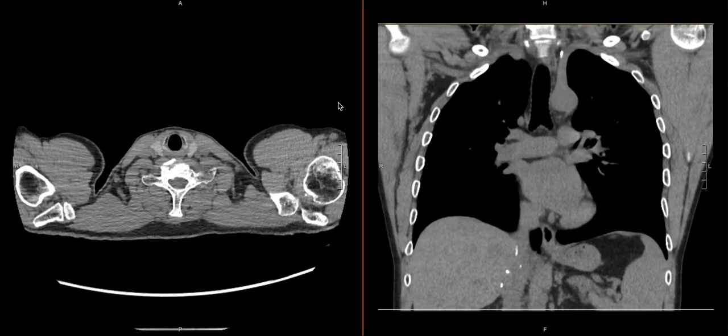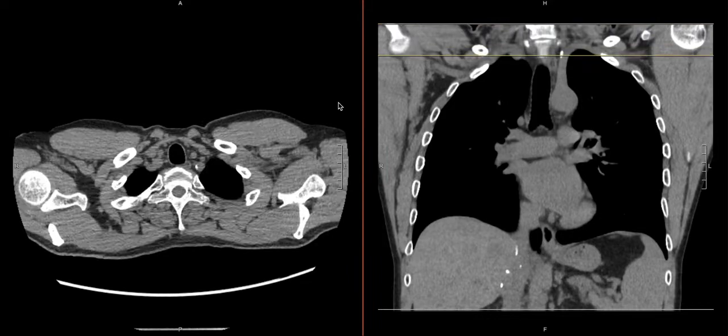Now we're going to discuss looking at the arteries. Even though this is a non-contrast study, we can oftentimes still appreciate some arterial pathology. It may not be the biggest focus of the study, and we may take what we see with a grain of salt, but it's important to build this into your search pattern with varying levels of extensiveness depending on what's going on with the patient.